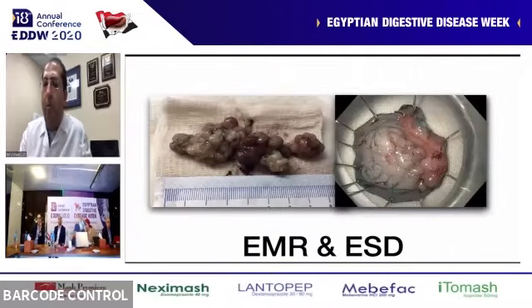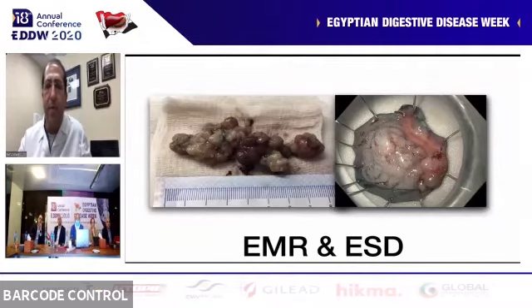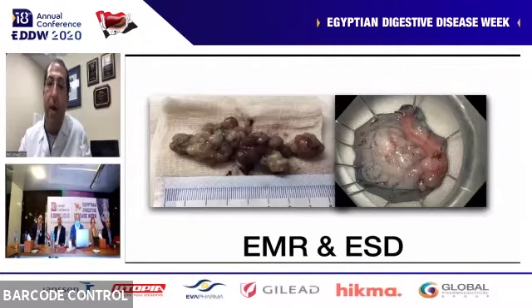So how about where the POEM came from? As you all know, there has been a change and progress. I like what someone says, that a lot of time we talked about these things as futuristic procedures, but we do it now. We do it every day. In fact, we did multiple POEMs this week. But you get what's called endoscopic piecemeal resection, for large colonic lesion or gastric lesion, as the prior lecture and the professor spoke about in detail in a great lecture.